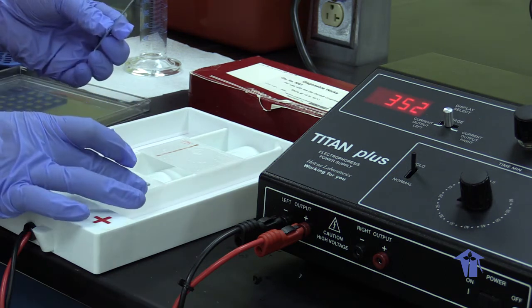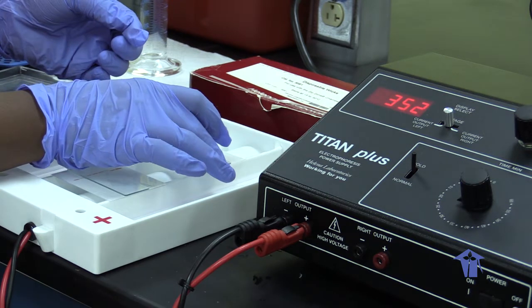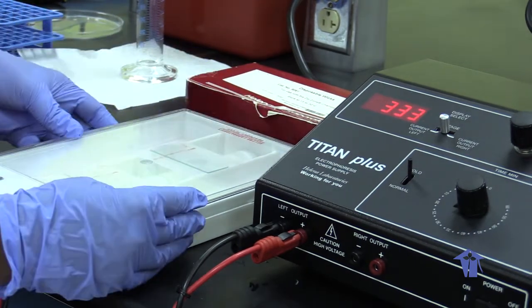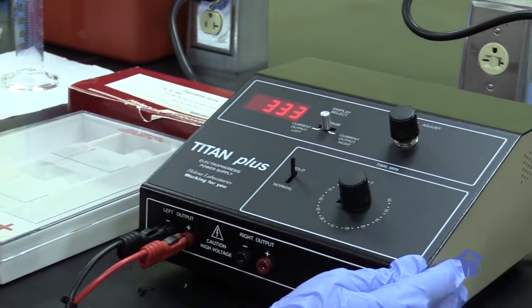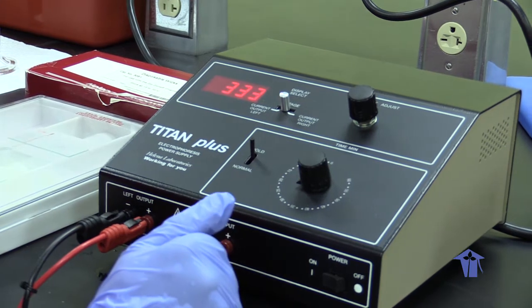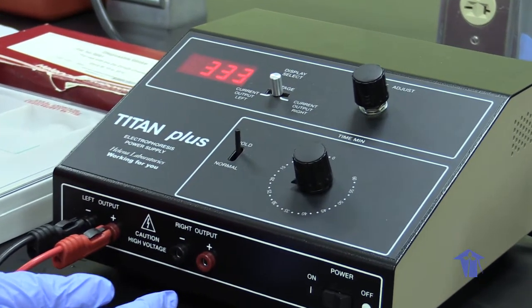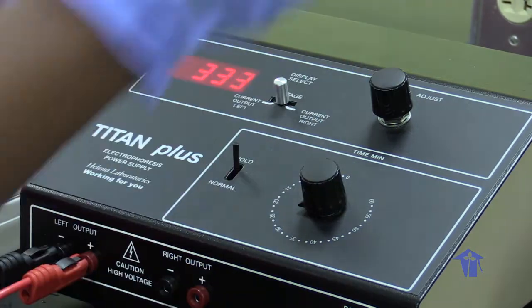Then it's just a technique I like to do. Put the slides on top as an anchor. Close. And then we set. The manual instruction says that we adjust the voltage to 350 for 25 minutes, and that's basically the machine settling to get to the correct voltage. And then we leave this for 25 minutes. Then we go on to staining.